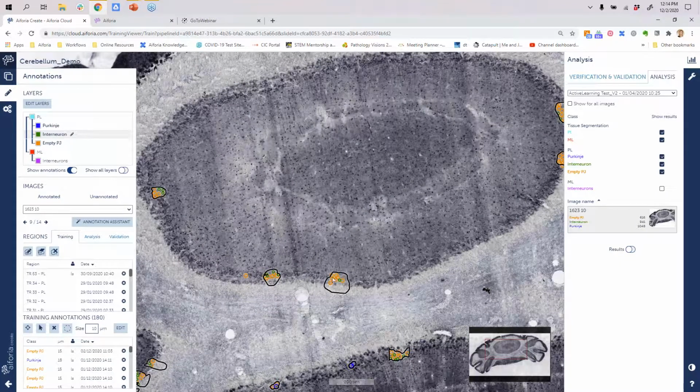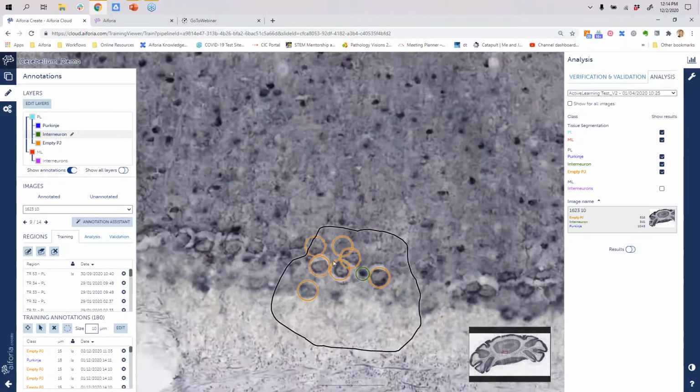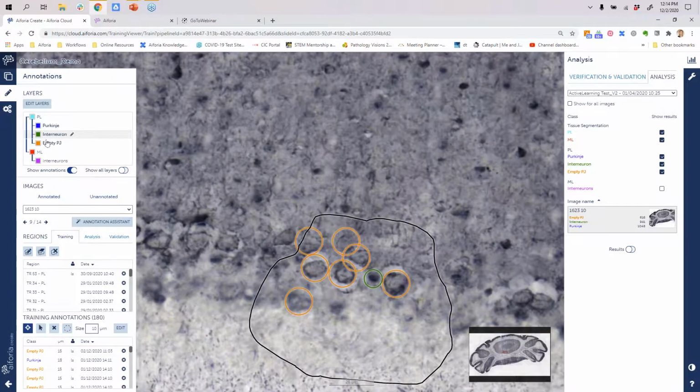So let's go back to this Purkinje layer cell populations. We have 3 populations here. Let's say you're annotating along and you've added annotations here, and a few annotations in, you realize, oh darn, I accidentally selected the wrong class. We now have a really nice tool: you just right click and you can immediately change the cell subclass. One thing you'll notice is that these cell sizes, or these object detectors, are now a different size than the rest of them in this class. Let's go see what we want those to be.